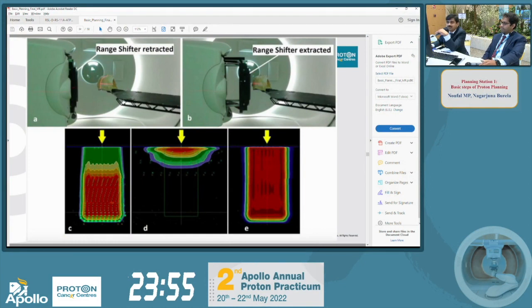And your question about the sinus filling, of course, the sinus is going to impact, because when we do a plan with the open sinus, and it's filled, it's going to change physics because the proton range is going to be different. How we are going to tackle that, we already have come up with a solution for that. That requires detailed discussion because we always incorporate these variations in our planning systems.